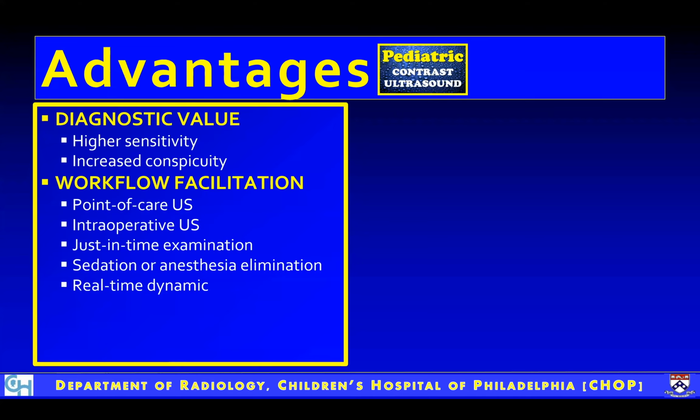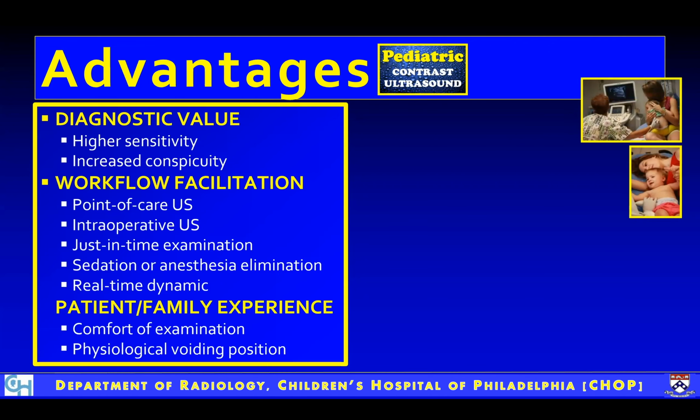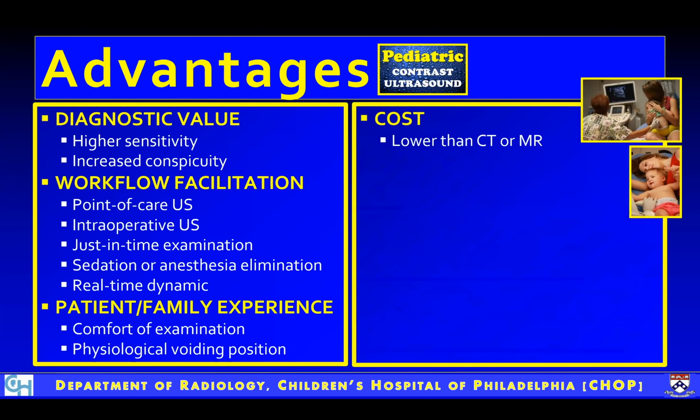Very good. For us in pediatrics, the elimination of sedation or anesthesia is of paramount importance, and in that role, contrast-enhanced ultrasound plays a big role. The real-time dynamic examination possibility has already been shown how it can be a big advantage. In addition to that, in pediatrics, the patient and family experience using contrast ultrasound can be very positive because of the comfort of the examination, and especially if you do, for instance, reflux exam, you can have physiological voiding position.